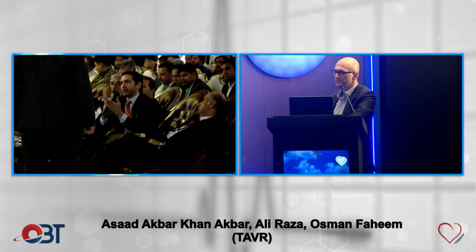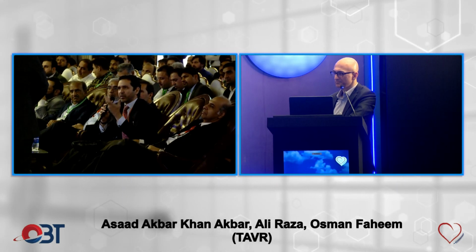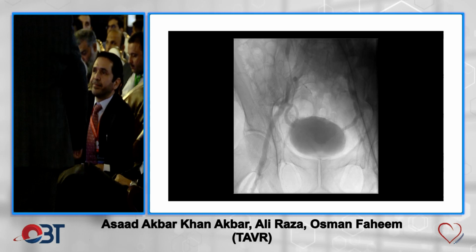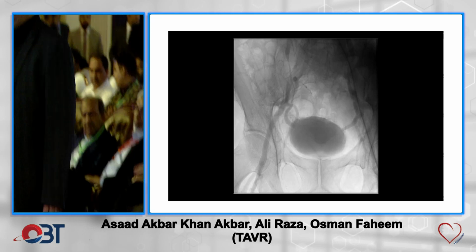Gada, who's one of the big proponents of cusp overlap, says use Landerquist for all your cases because you get much better support. I guess with the cost issue or non-availability of Landerquist. No, I think Landerquist and Confida price is the same. It's the non-availability in Pakistan.